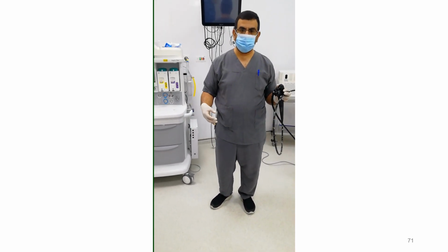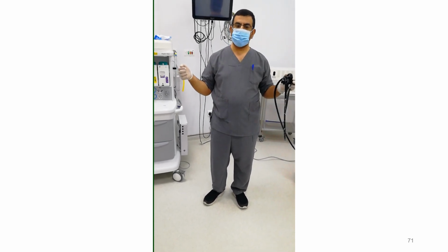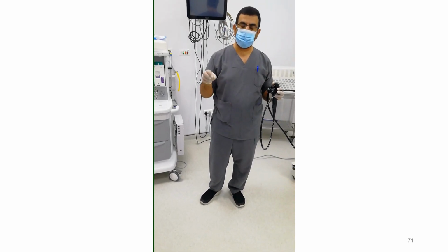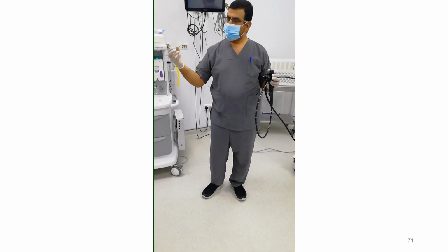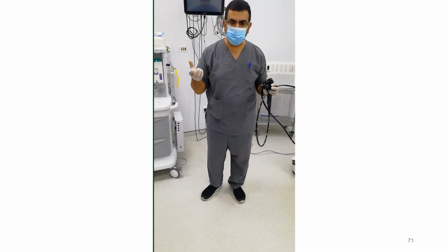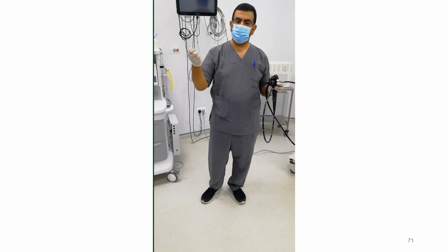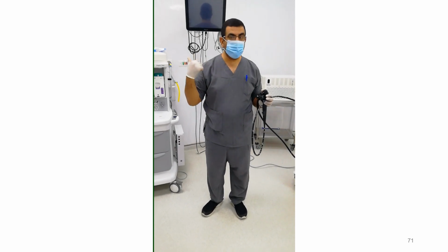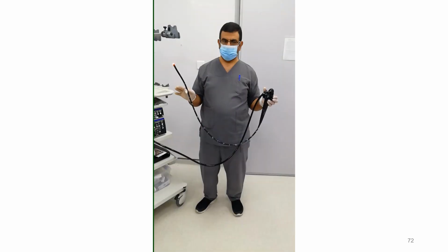ليه؟ أحيانا تبقى حضرتك داخل في أمان الله، عيان عنده إسوفجيال فارسيس، فجأة الفيلد بقى كله فاضي وحضرتك مش شايف أي حاجة. فمن أضر العلاج في هذه الحالات، خاصة لما يكون في أكتف بليدر، إنك بتعمل بلايند باندنج. طيب أنا جاي بهذا الباند، الدنيا كلها دم مش شايف كويس، يا ترى أنا هعمل باندنج فين؟ الصح إنك توصل لور إسوفجيال جنكشن أو زي لاين وأروح طالع سم أو 2 سم وأعمل باندنج. يمين شمال فوق تحت يبقى ده بلايند، لو أنا مش عارف من الأول اللور إسوفجيال جنكشن بتاعتي فين أو الزي لاين.